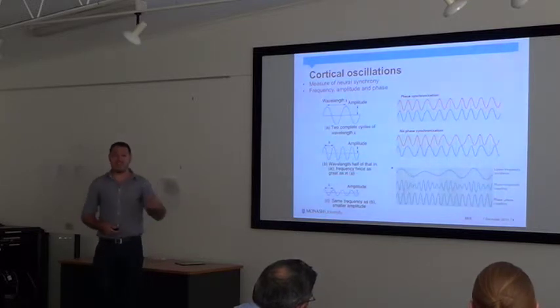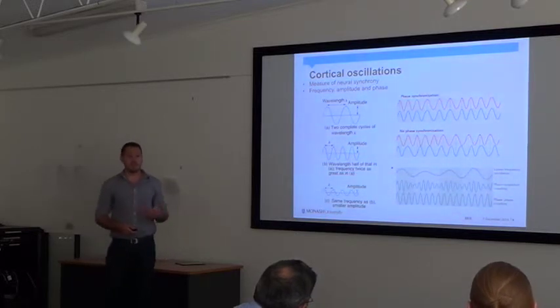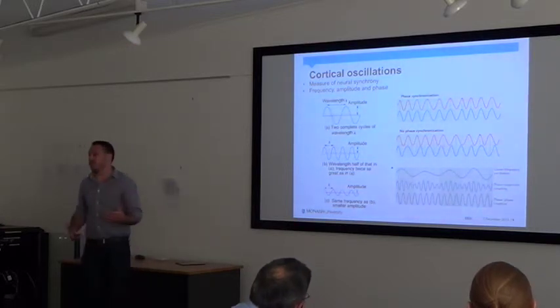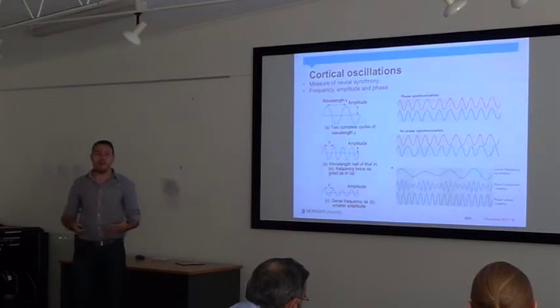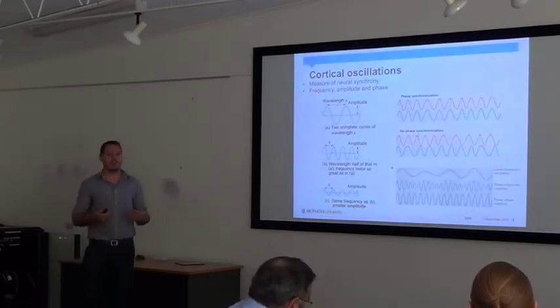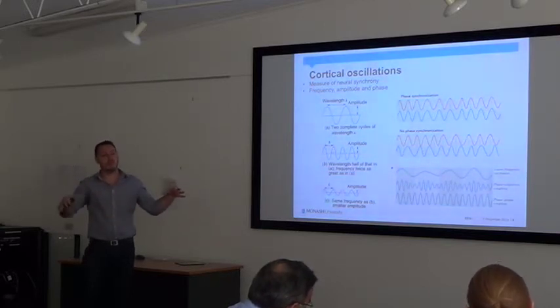Some typical analysis techniques such as coherence have been the mainstay of this field, but there's some more complicated analyses that are starting to come out now that are looking at phase lags in between here to get more directed maps in terms of if an area is having an influence on another area.